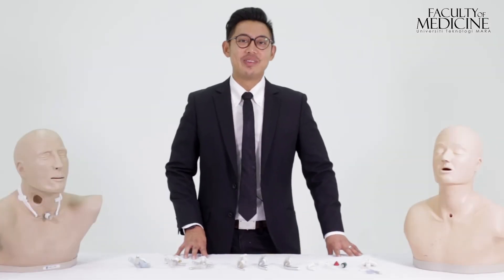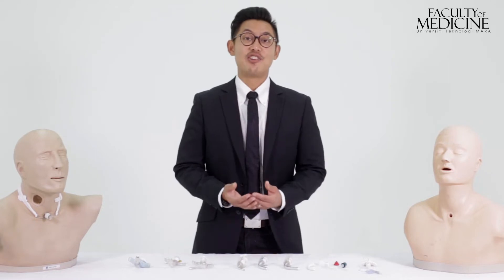Now, let's get better acquainted with the star of our video, the tracheostomy tubes.